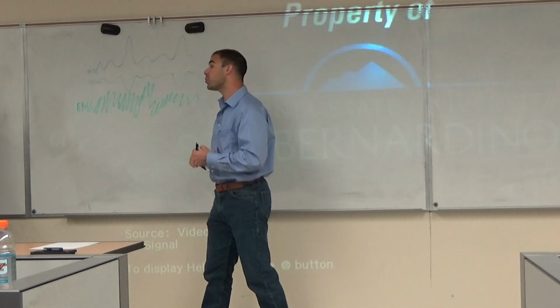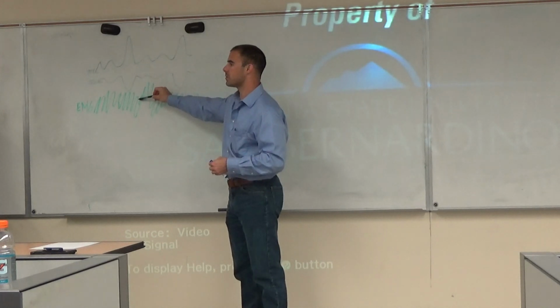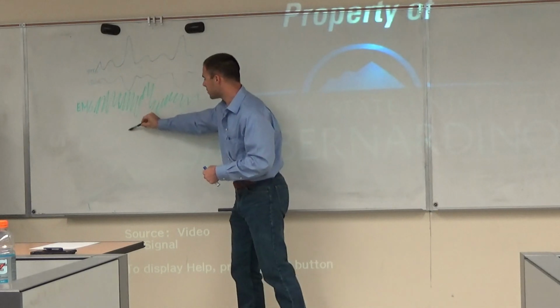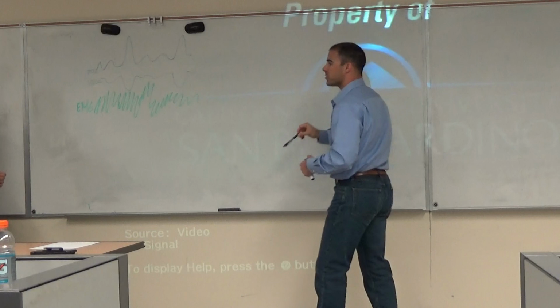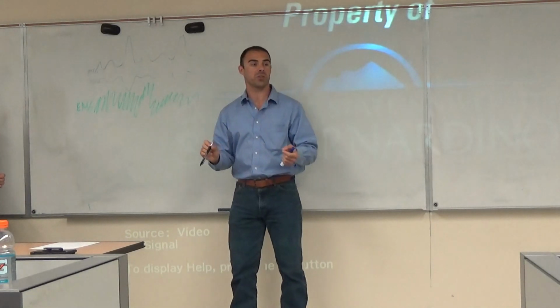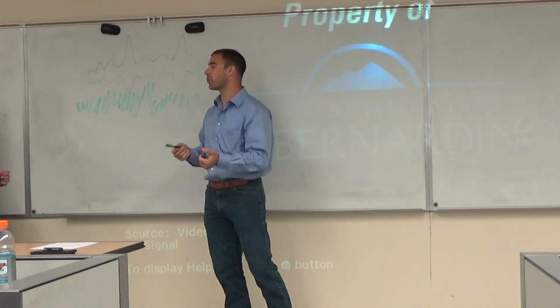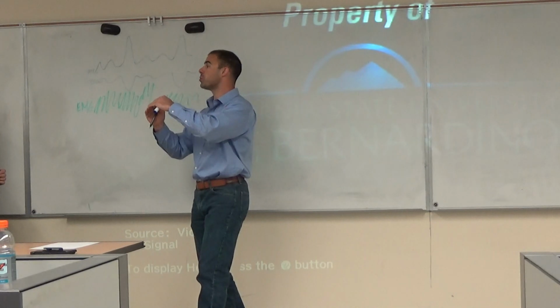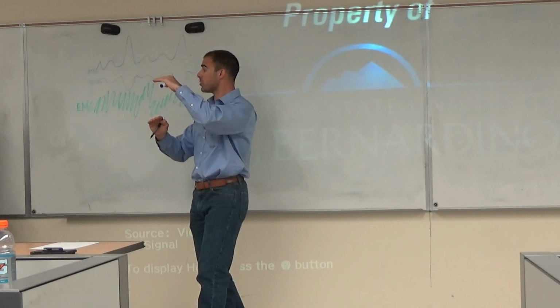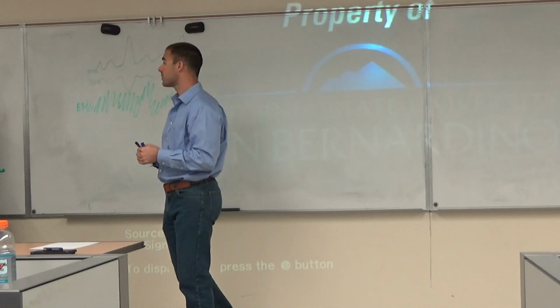Really, really high. So what's the difference between frequency and amplitude in this graph? Amplitude is the height of it. Yeah. So the frequency is how many times it goes up and down. So tension is not necessarily indicated by low frequencies. It would certainly be higher frequencies, but when we would see greater degrees of it, we would probably see it in the amplitude, not the frequency changes. Good job.